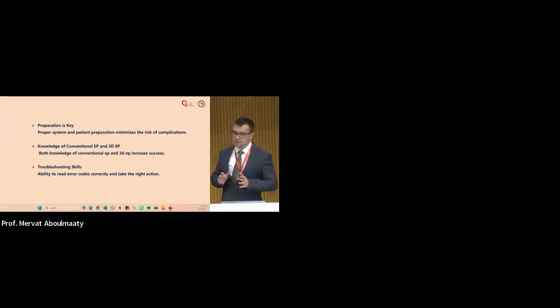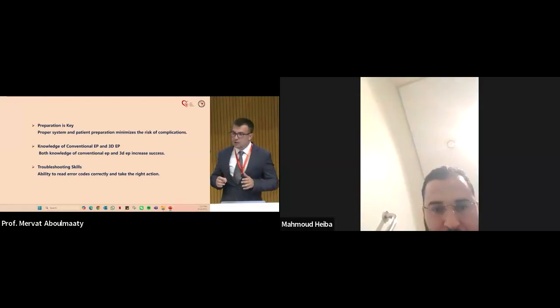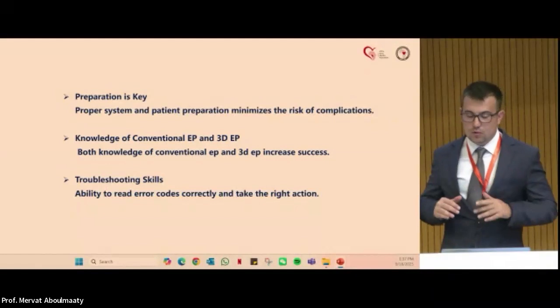Key takeaway from 3D mapping support: preparation is key. We need to prepare the patient and the system well. This minimizes the risk of complications.